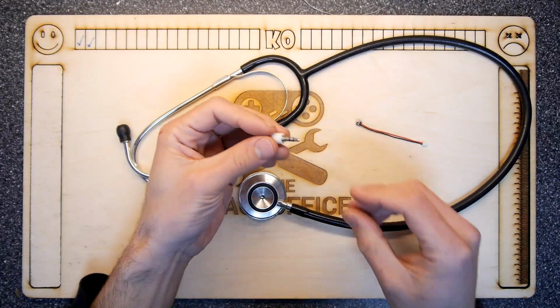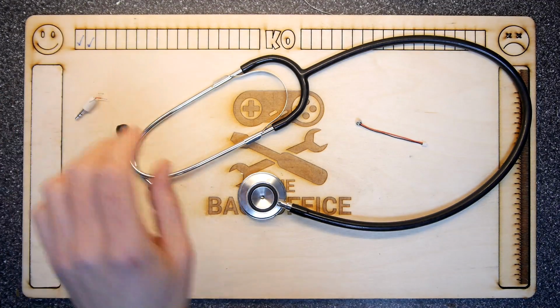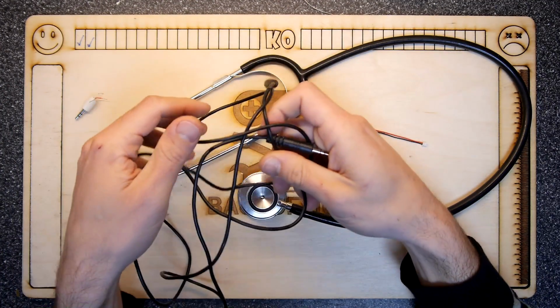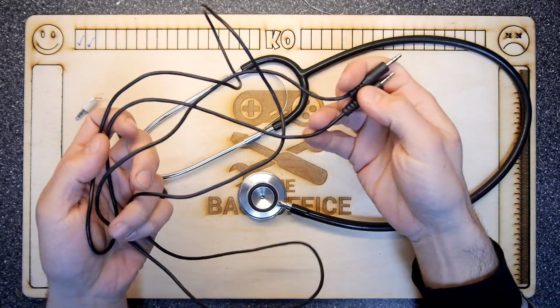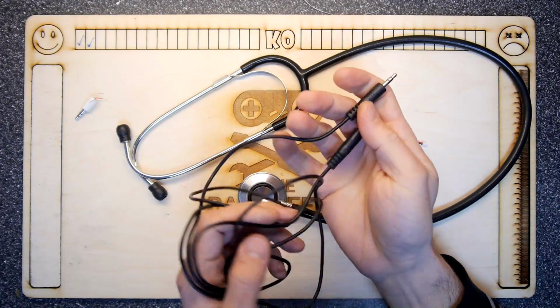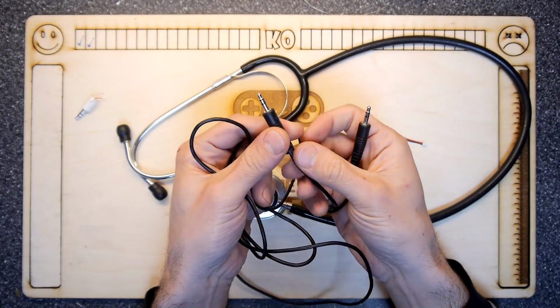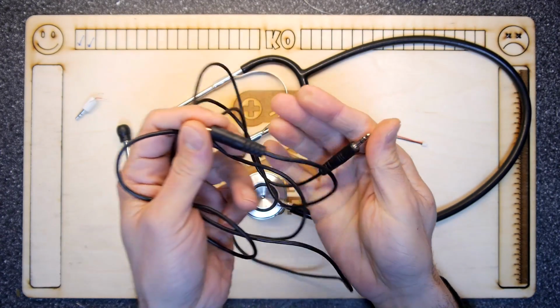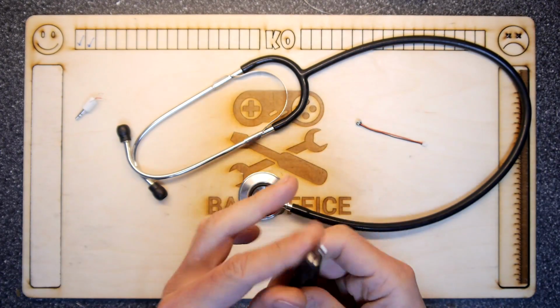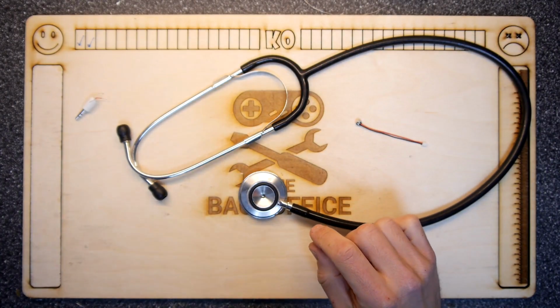You'll need something like this, which is a DC jack. In fact, this is one I've cut. But what I'm actually going to use is one of these. I suggest it if you've got them, because sometimes you have them going between a monitor or a PC, or from your car radio to your old MP3 player. These are really useful because we're only going to use one end, so we can keep the other end with the jack on, and it's all nicely over-molded so it's not going to break. Plenty of length is good, about as long as however far away from your computer you want to be using this.